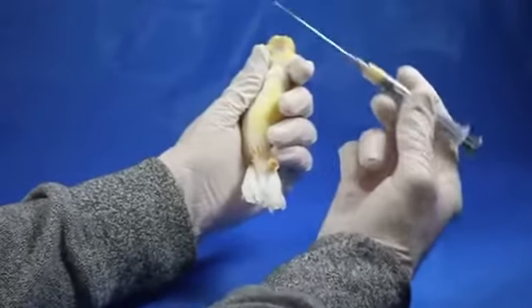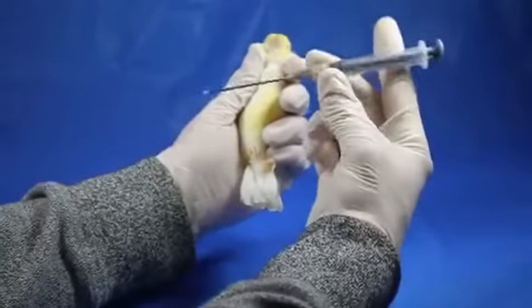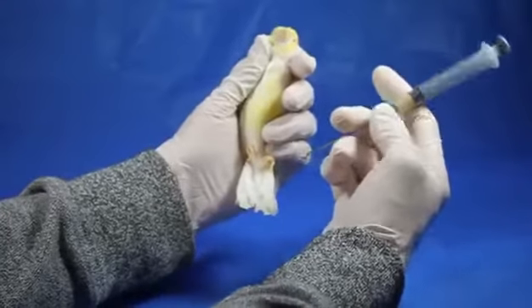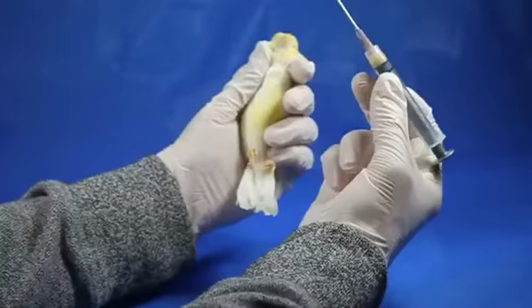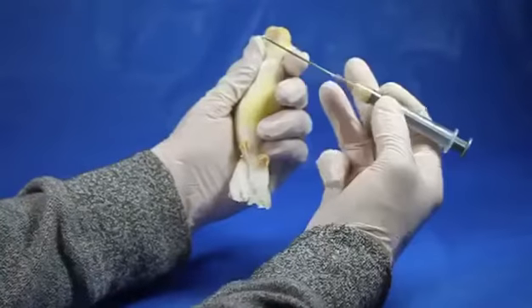So we are going to use the crop feeding tube to get some of this medication in. I've mixed it with a little bit of hand rearing formula so it's going to get a little bit of nutrition as well. Now this particular needle is a disposable crop feeding needle rather than the permanent metal ones.